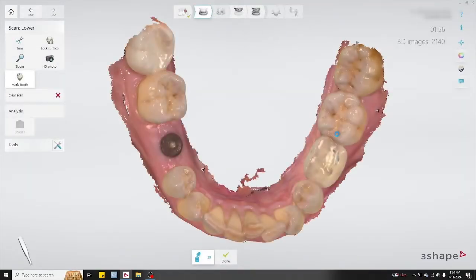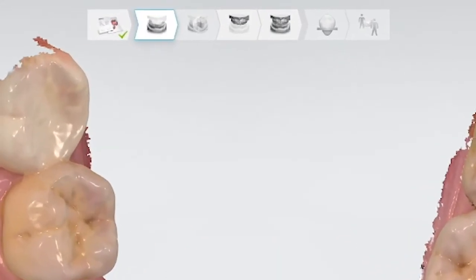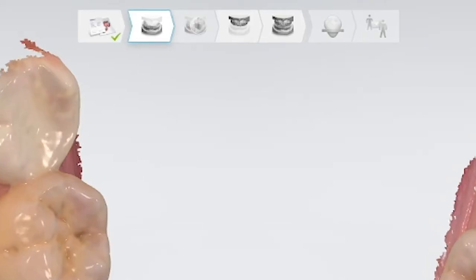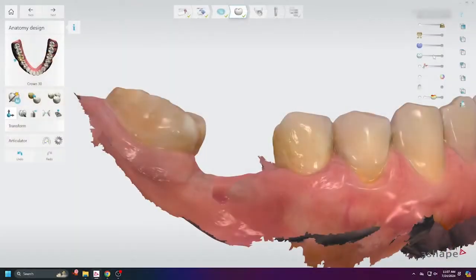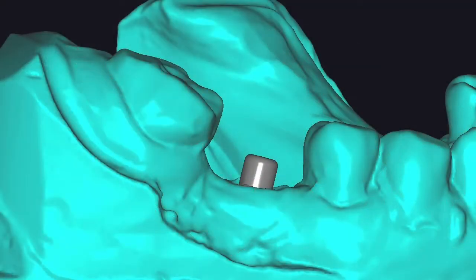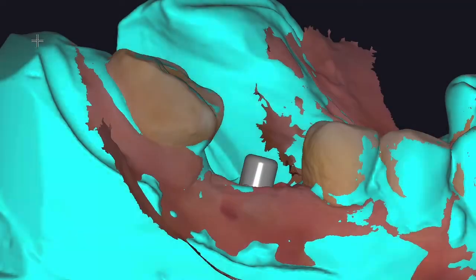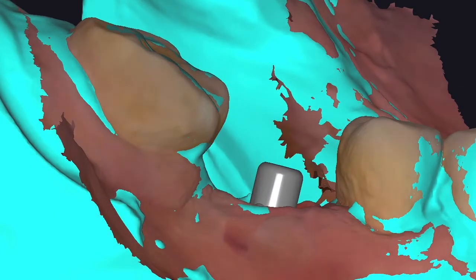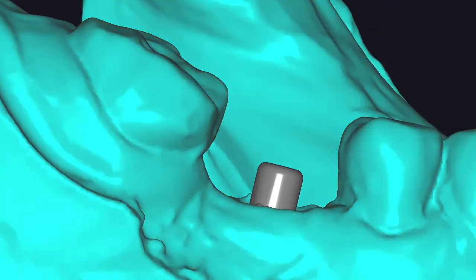When you get to the scanning segment of the workflow, you'll notice there's an extra window at the top that's grayed out. This window will be activated once you've completed the scan of that arch. Before you start scanning, look at the interproximal surfaces of the adjacent teeth — sometimes you need to modify them to improve the contours of the interproximal contacts. This decreases the black triangle caused by large embrasure spaces and also minimizes any chance of food traps in that area.